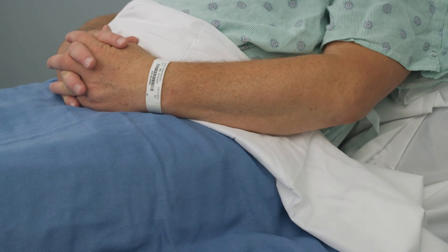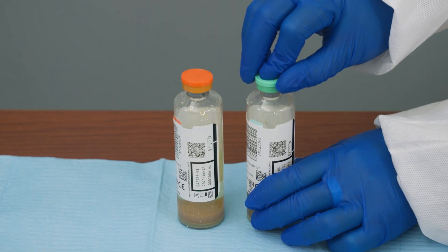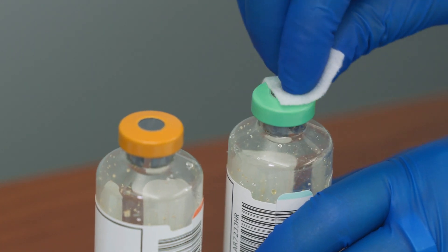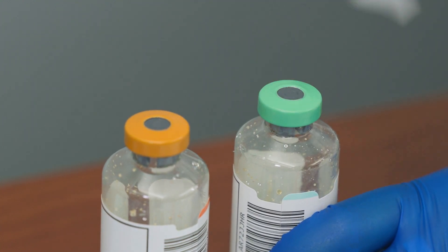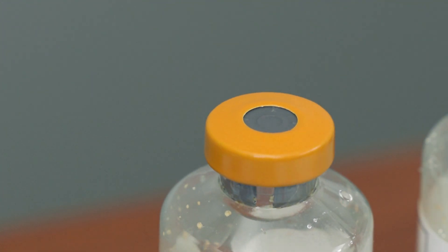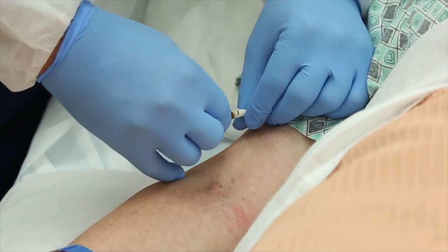Prepare the collection materials in a clean protected area to help minimize contamination. Remove the flip caps from the blood culture bottles and disinfect using an approved disinfectant, using a fresh swab or applicator for each bottle. Remove the swab or applicator and allow bottle tops to dry completely.